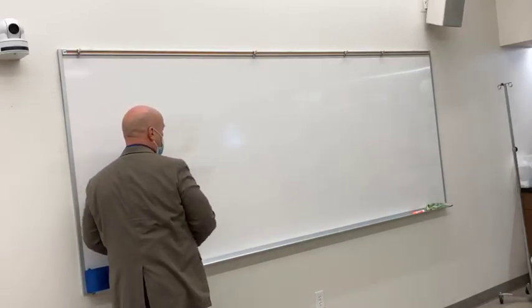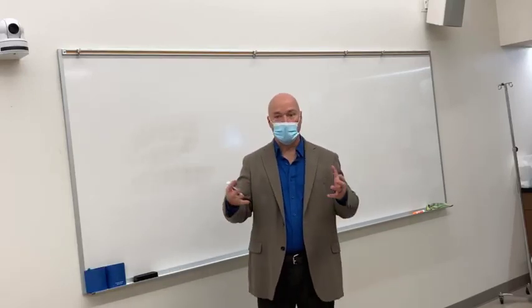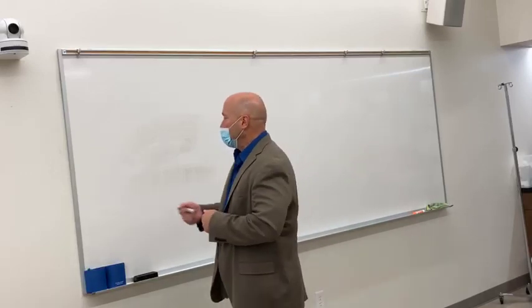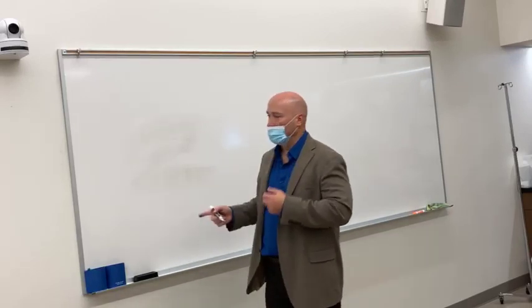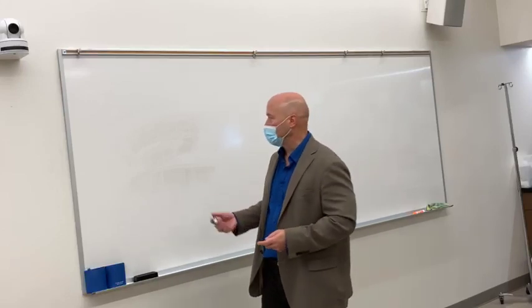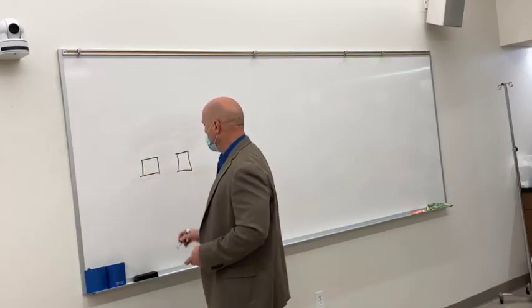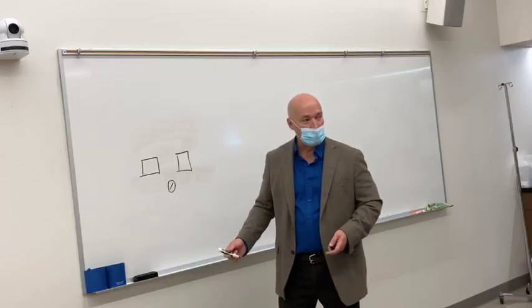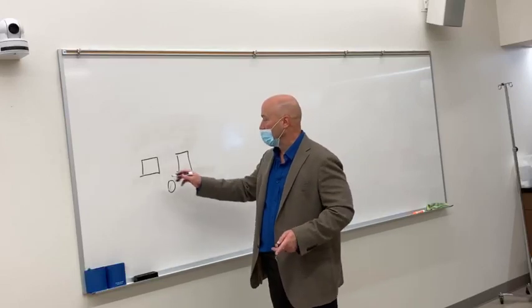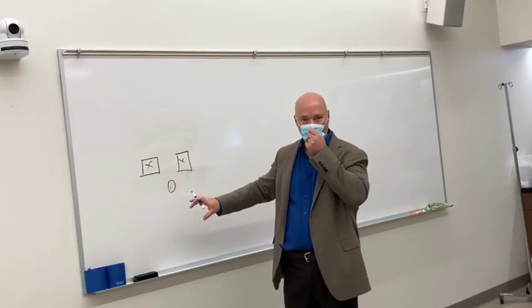Again, I wouldn't recommend you spend a whole lot of time studying your configuration whenever you get to clinicals and you're actually taking a patient, but get in the room and play with your machine. What you'll see in a lot of cases is you can figure out the photocells and the photocell arrangement whenever you're selecting different exams. So if you're shooting chest X-ray, chances are what you're going to have are these two energized and that one not. If you're shooting KUB, in a lot of cases, it's going to be the same thing. If you're shooting a T-spine or an L-spine, chances are those are not going to be energized, but that one is, because that's where your spine should be on your image, right?